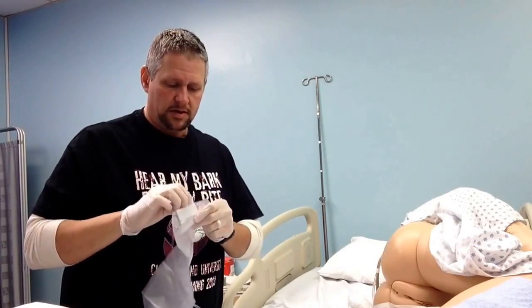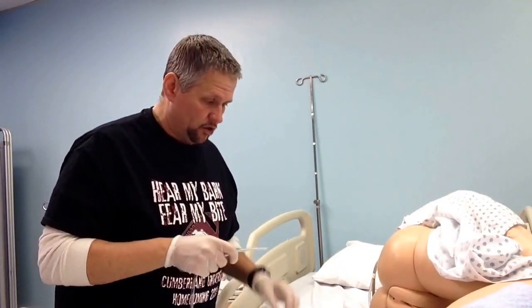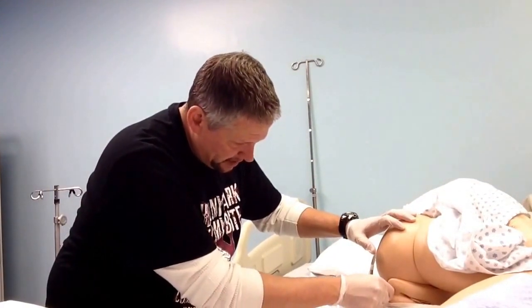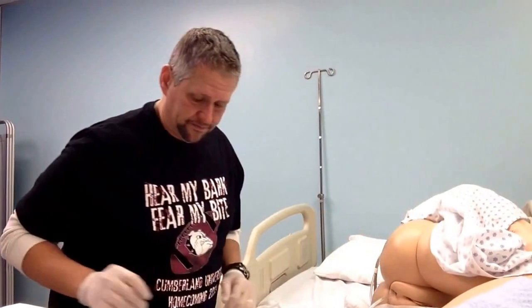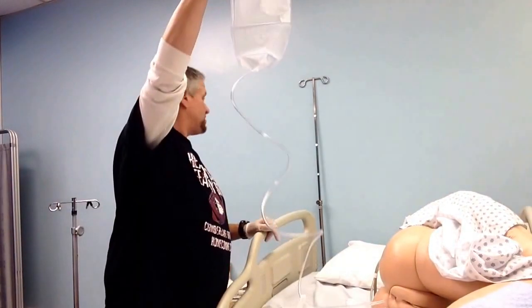Go ahead and get our enema bag ready. We're going to put the Castile soap and the saline in it to get it prepared. We're going to go ahead and generously again lube this up. We're going to insert it into the rectum slowly, making sure the patient's able to tolerate it. We're now going to start our infusion of the warm enema slowly. We're going to make sure the patient can tolerate it at hip level. If the patient's able to tolerate it at hip level, we're going to go ahead and raise it now, 12 to 18 inches.